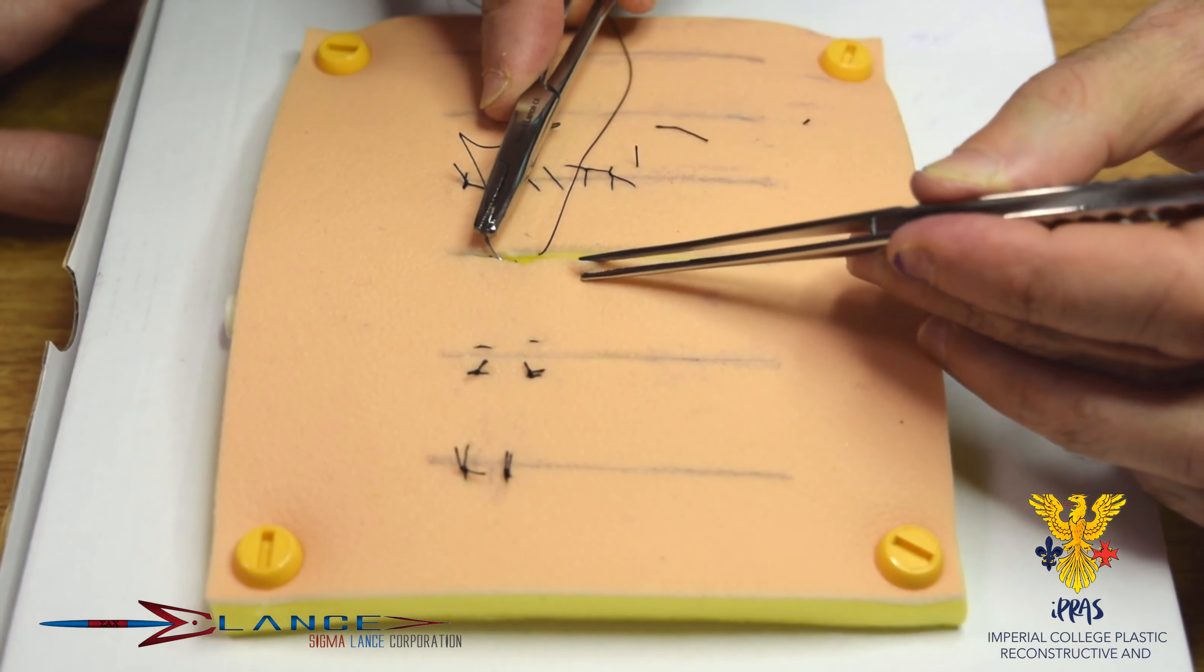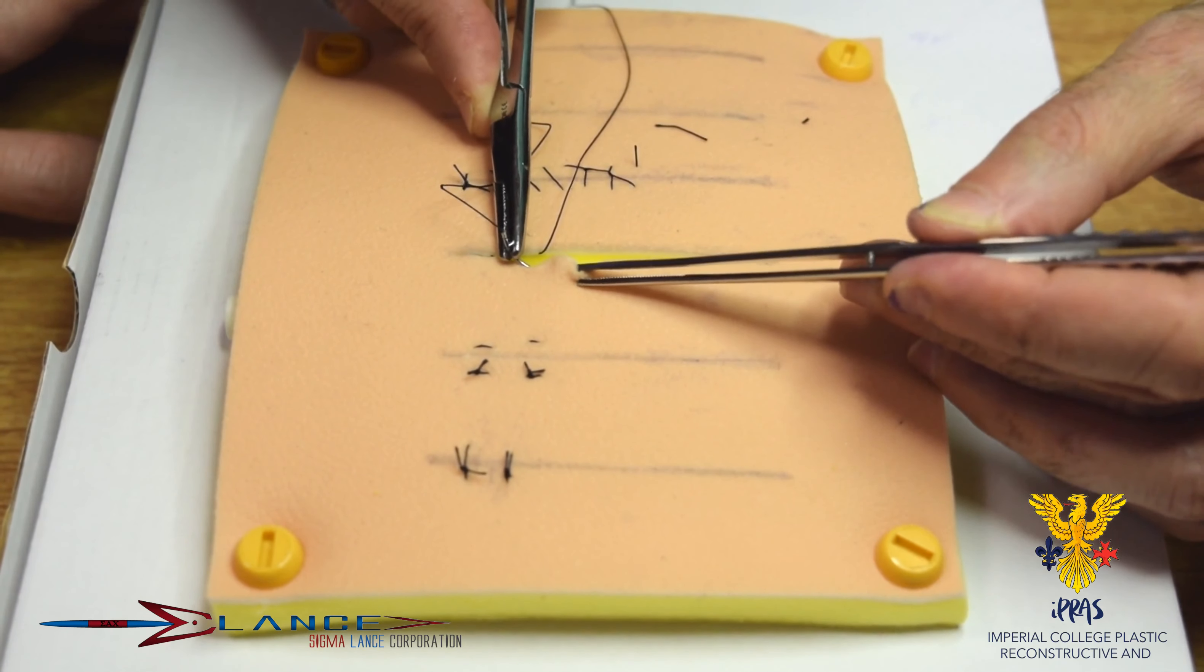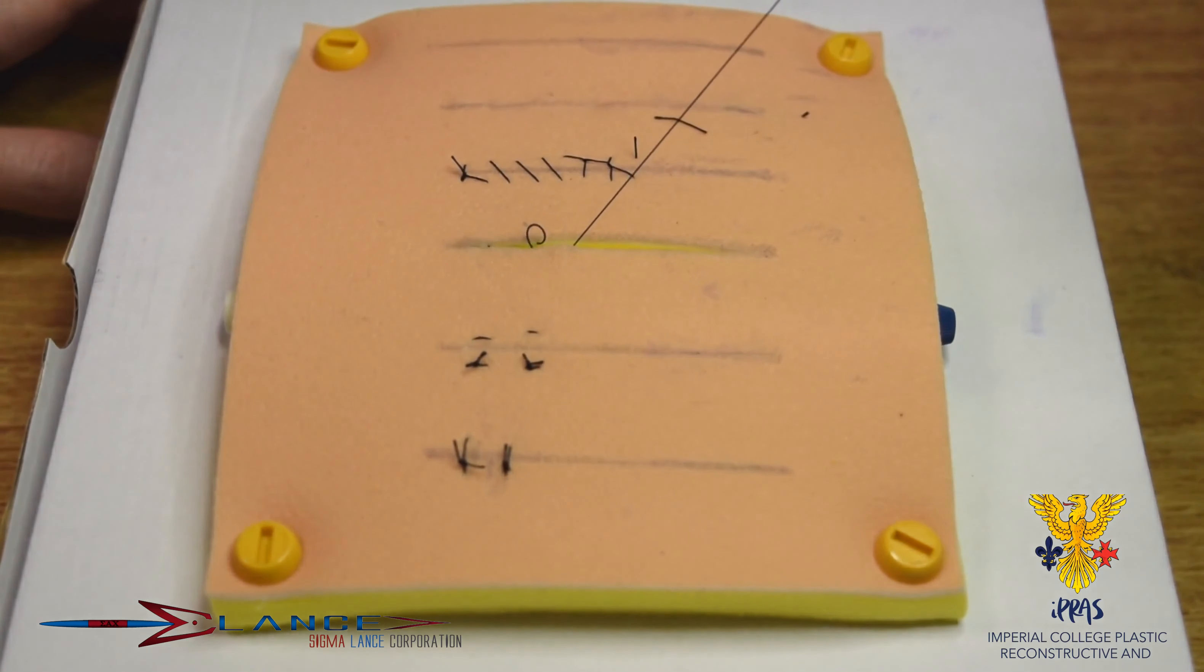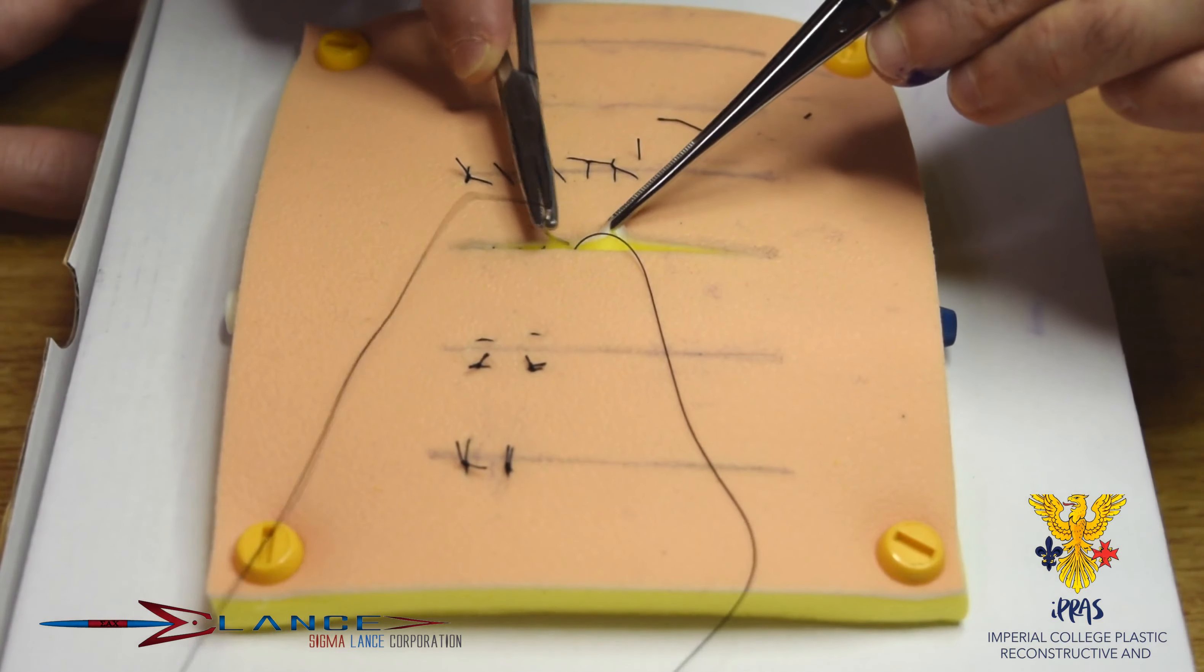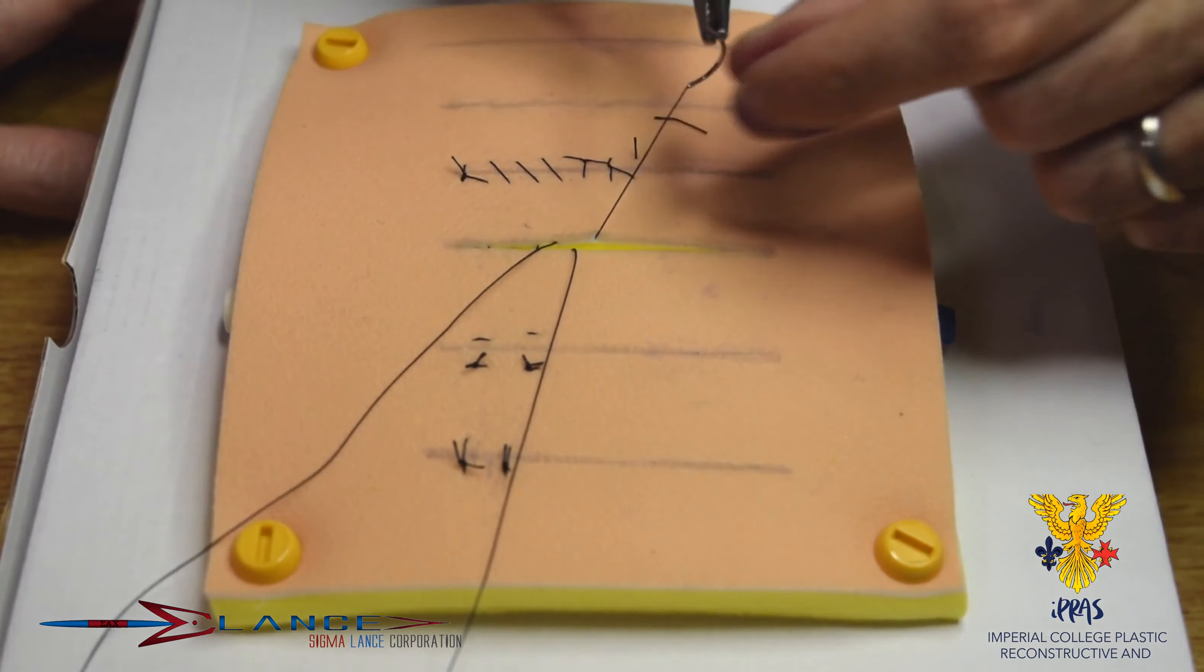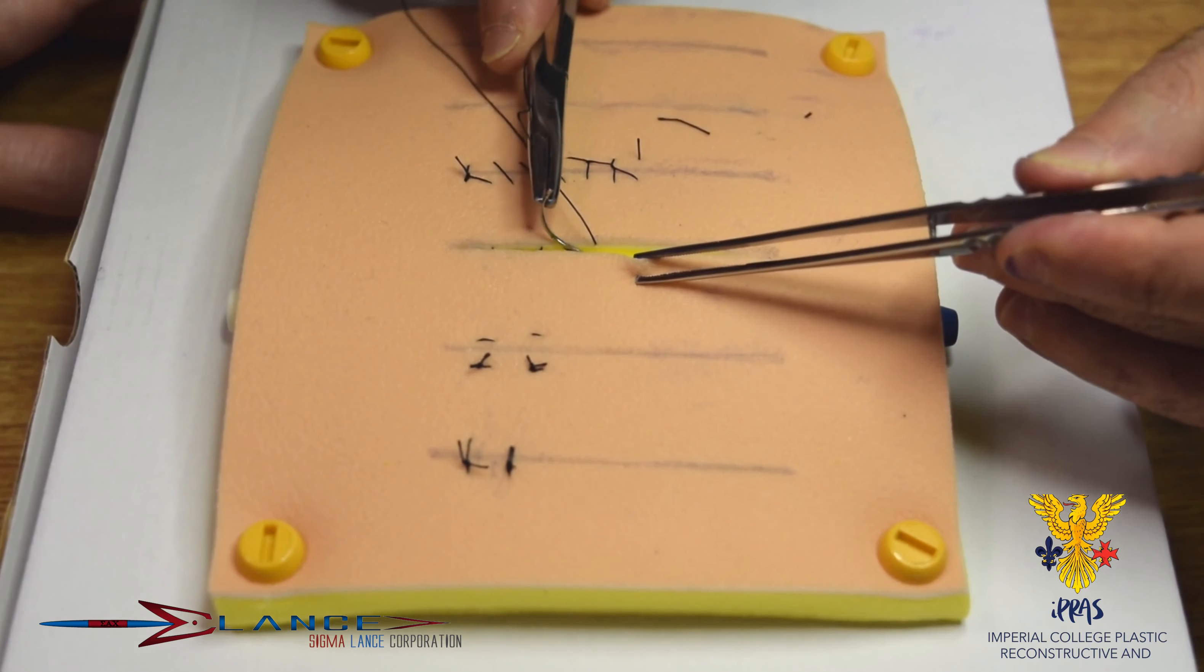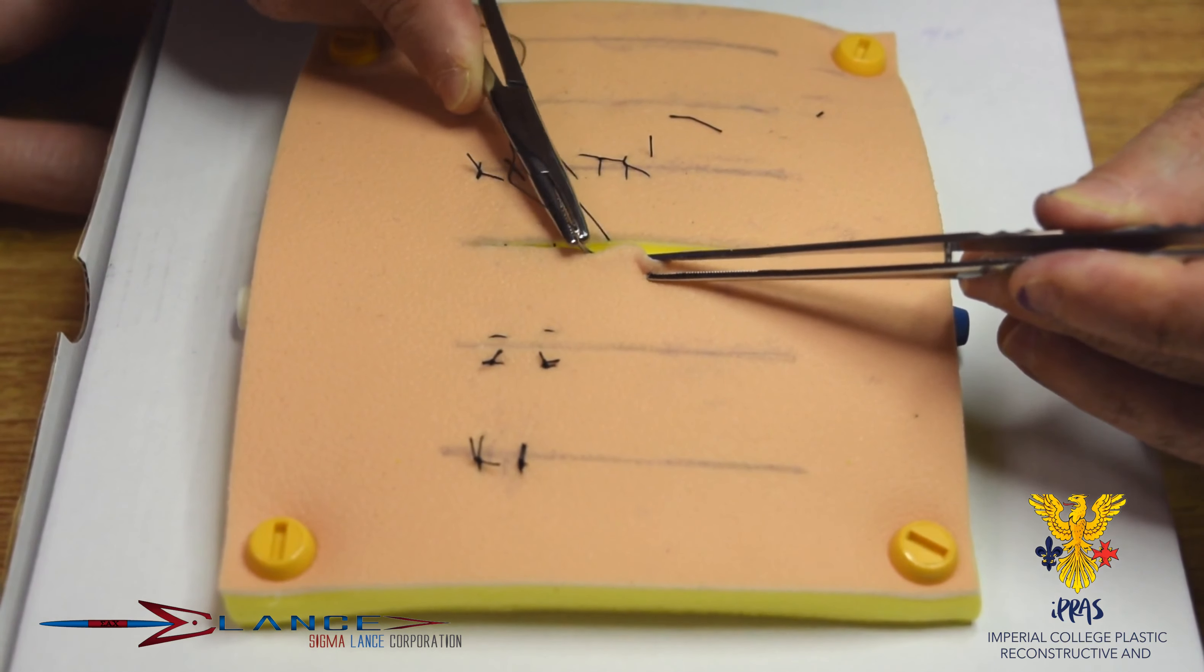You might find your needle toggles a little bit in these needle holders, so you must try and stay in this white dermal layer. And again, trying to concentrate on supernating your hand and not trying to push it through. So you can see that we're getting a slightly zigzag appearance to the suture line.